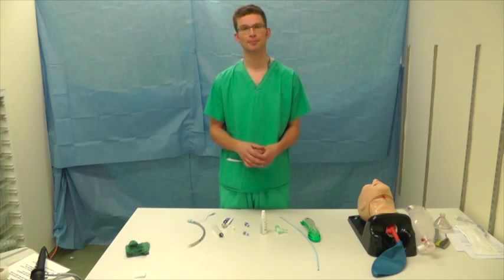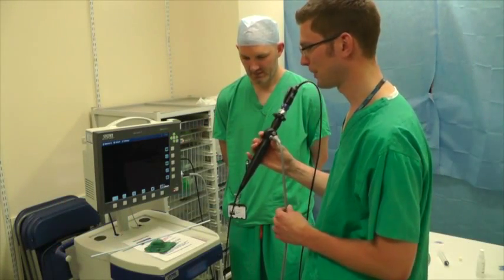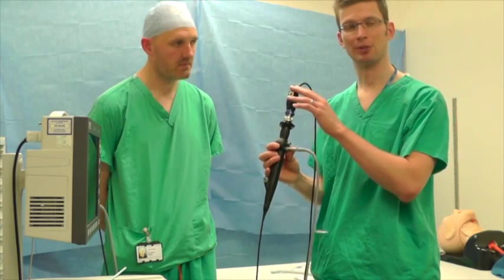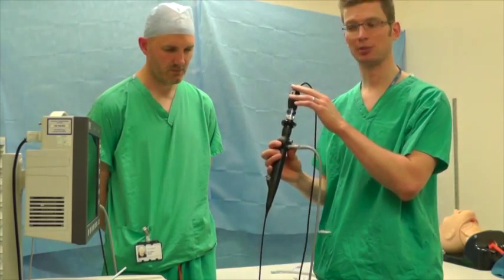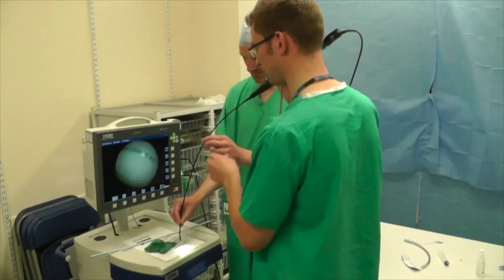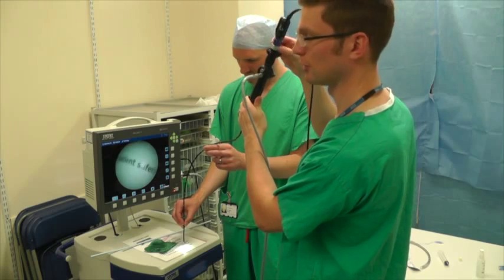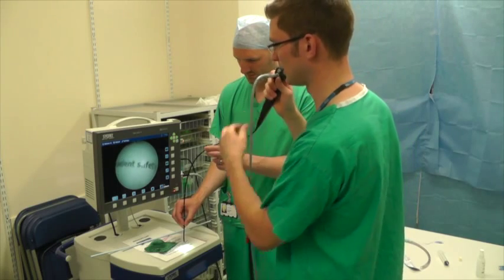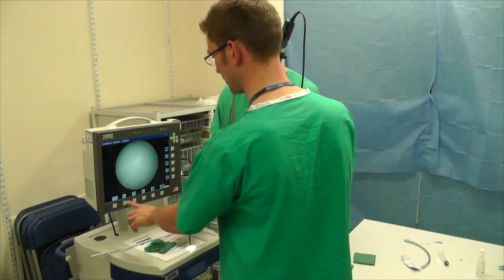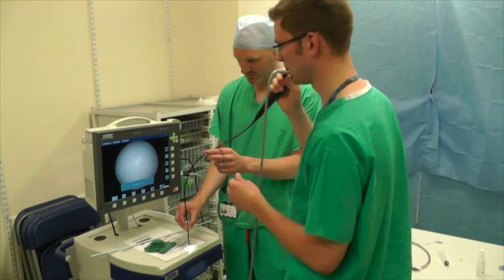Now let's have a look at the camera. In terms of setting up your camera and scope, the light source and camera will be attached already. For focusing and white balancing, ask your ODP to hold it over some text or a name badge, and you can focus it using these diopters at the top. For white balancing, focus on something white and just press this button here — that's done.